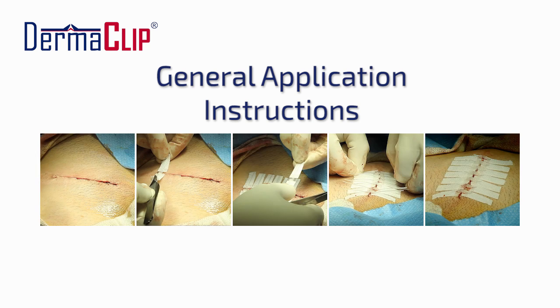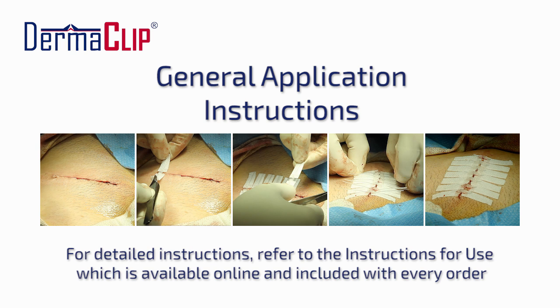Here is a video showing the application process for Dermaclip. More information can be found in the instructions for use available on the Dermaclip website.